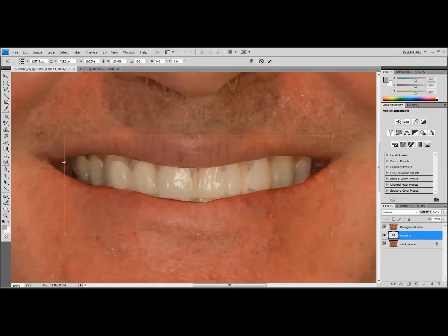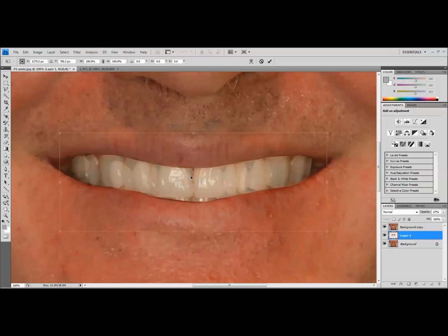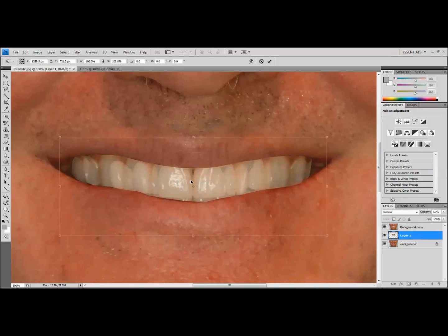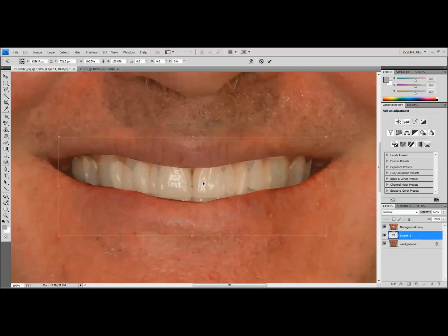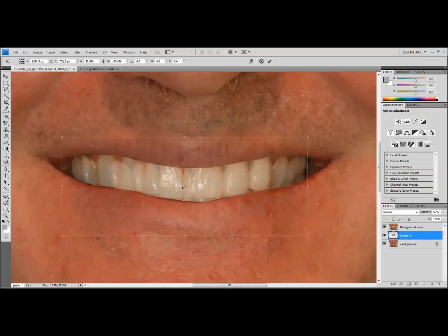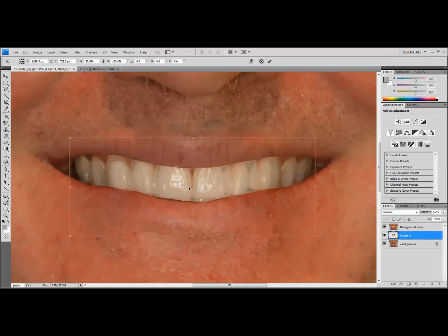So we're still in free transform mode. The first thing I'll do is I'll start moving this image around until I line up the embrasures between the centrals. I want to get that centered right there. And if you can see in this ghost image, the patient's original tooth is about this width, whereas my simulation is a lot wider. And so I can tell right off the bat, I need to start skewing this down to try and get it to match up a little more realistic. The reason I want to do this is because there's no point in showing your patient a simulation that you can't even remotely come close to matching in their own mouth.